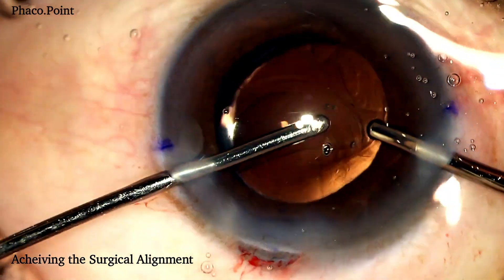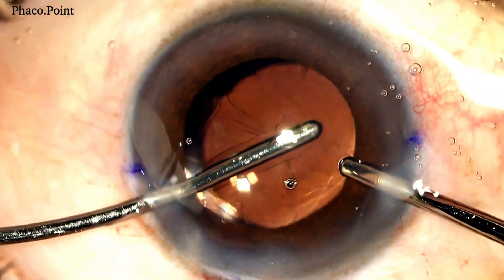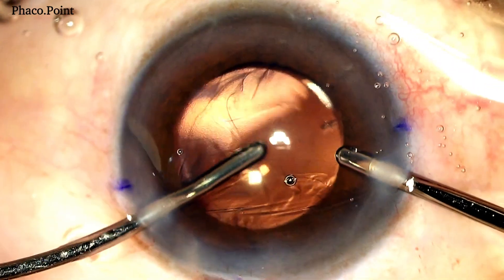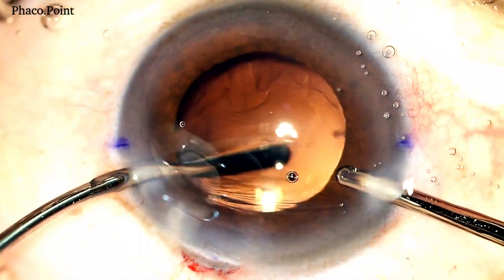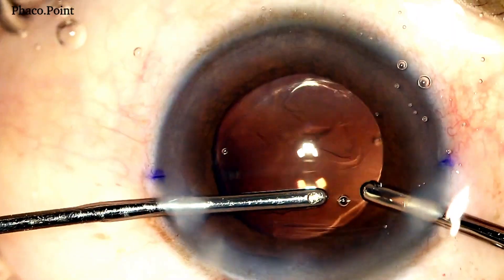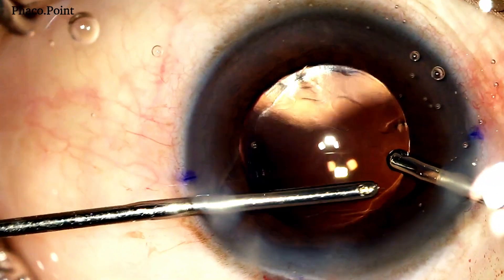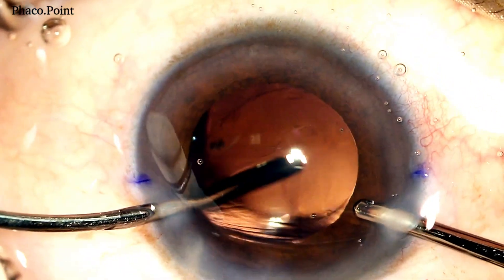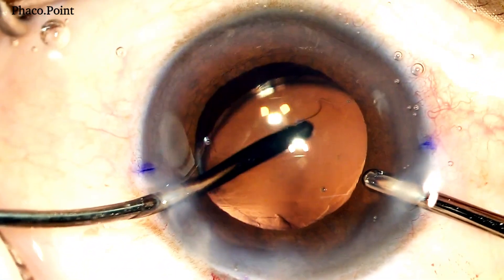Here's how it's done. I generally use bimanual irrigation aspiration to achieve my final alignment. The IOL is nudged posteriorly to remove some of the viscoelastic behind the IOL. The viscoelastic is also partially removed from the anterior chamber, and with the help of the irrigation and aspiration cannula, I gently rotate the IOL to achieve what I would consider my perfect alignment.